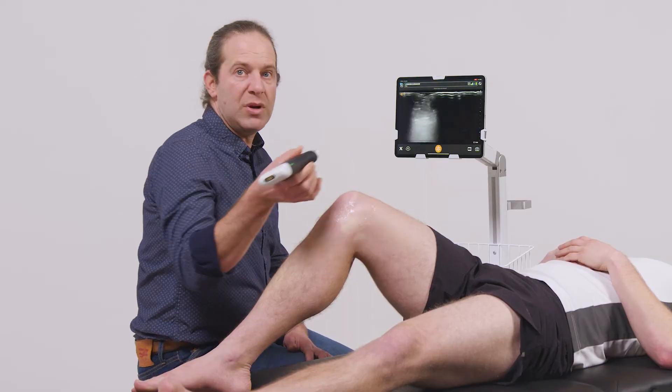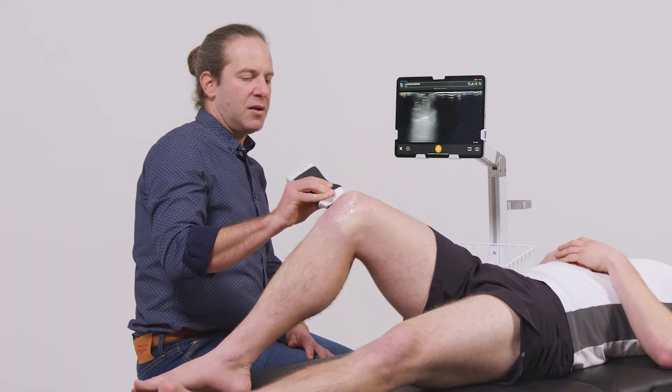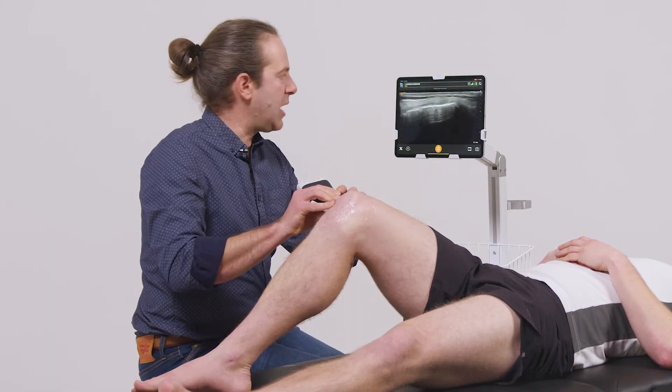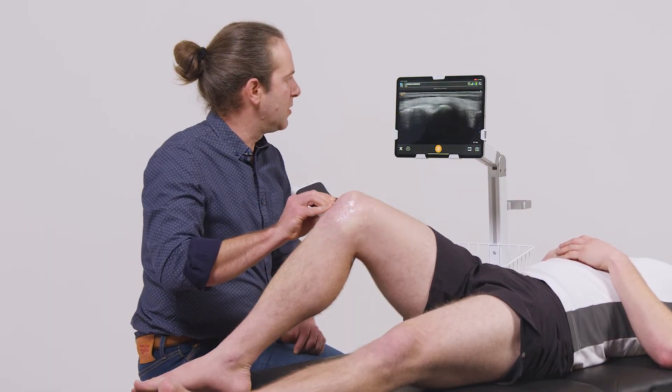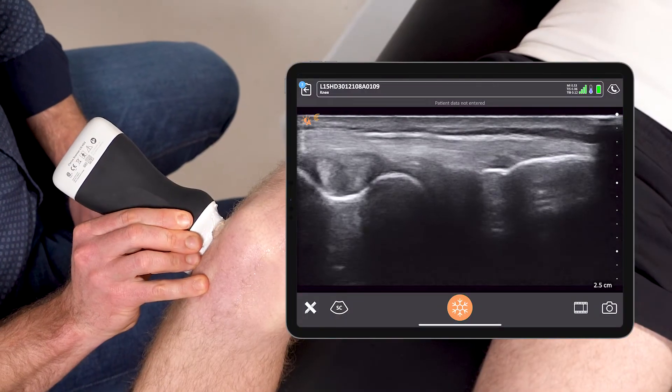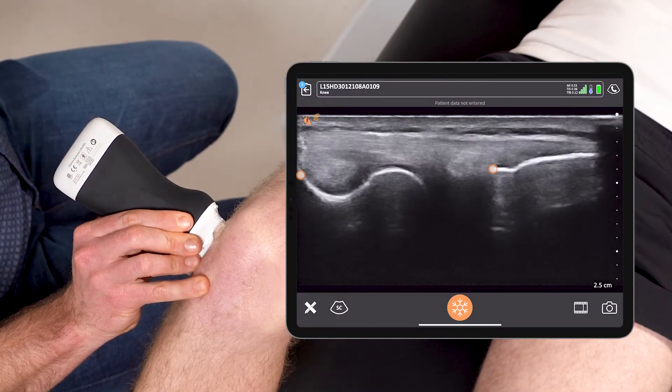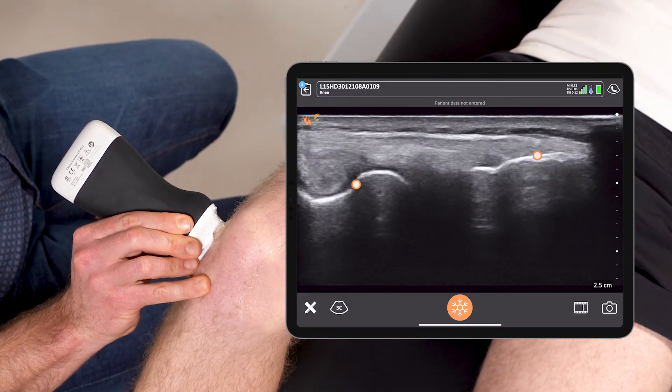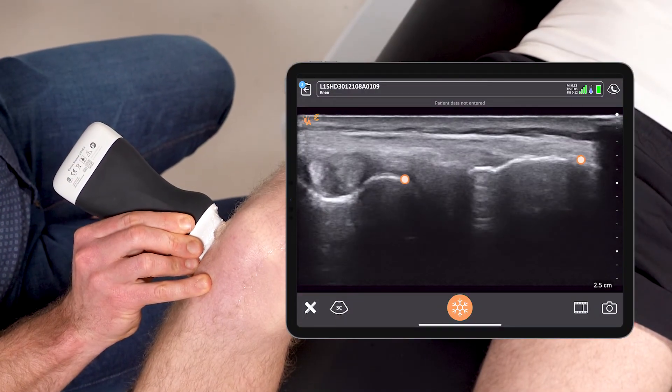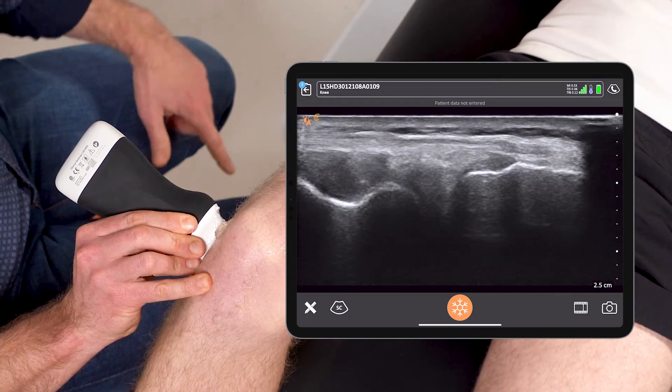I can then repeat the same scan for patients with lateral knee pain on the lateral aspect of the knee. Once again identifying femur and tibia, here's the lateral collateral ligament.